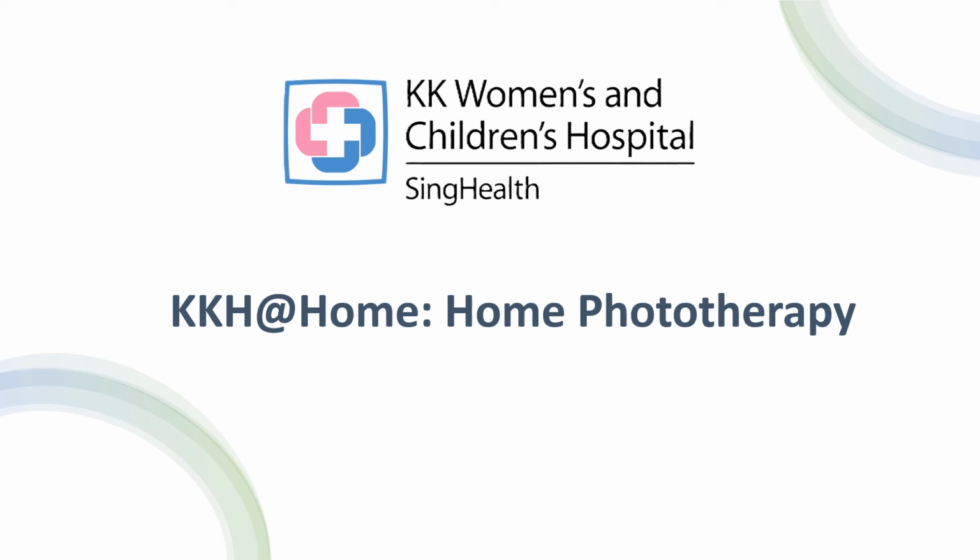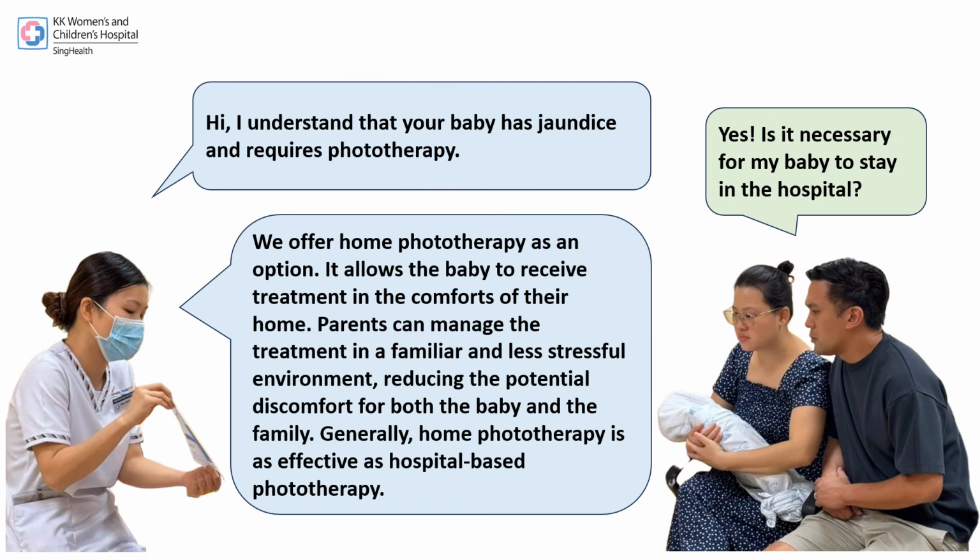This video will explain the home phototherapy program for babies with jaundice requiring treatment. Hi, I understand that your baby has jaundice and requires phototherapy. Yes, is it necessary for my baby to stay in the hospital? KKH now offers home phototherapy as an option. It allows the baby to receive treatment in the comforts of their home.